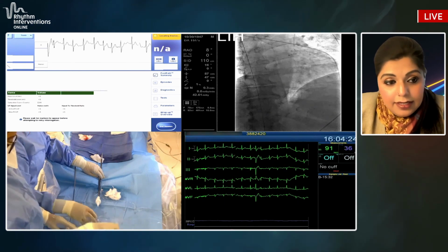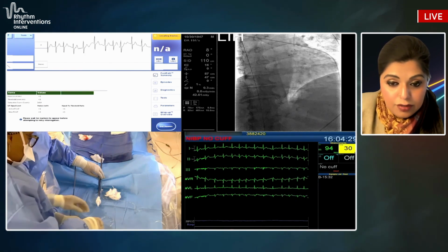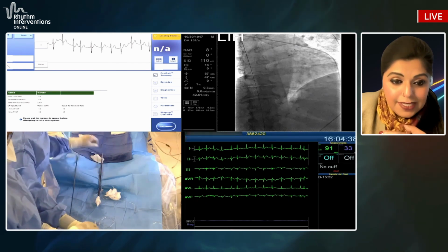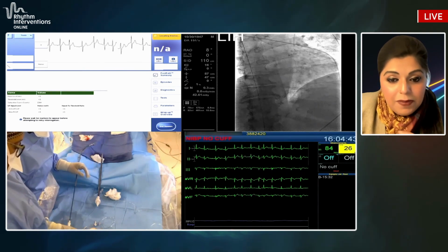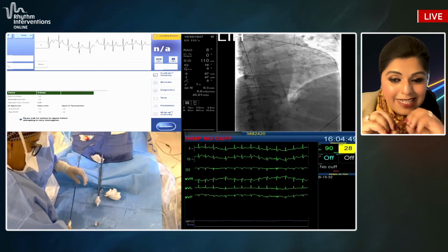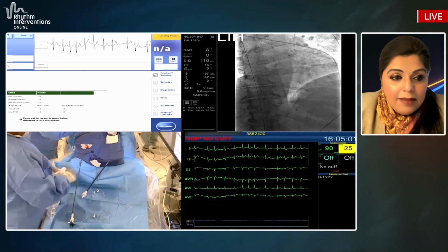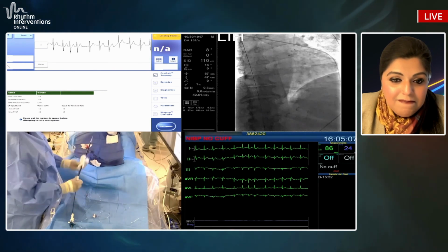You can see us connecting the delivery system to the irrigation ports. So there's 3 irrigation ports, as I said. The first one is to the valve bypass tool, and that's just a heparinized bag to gravity. The second one is to the protective sleeve, that's a pressurized saline bag, and the third one is to the handle, which is also a pressurized bag because the lumen is extremely small. And once you have it all flushed and de-aired, you just let it all drip at about 1 drop per second. So this would be a good time for us, maybe Richard, to come back and see where we want to go.